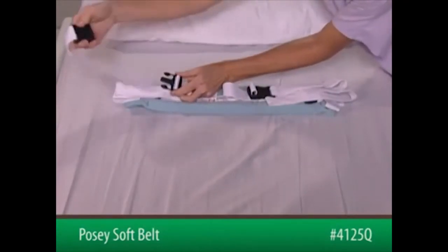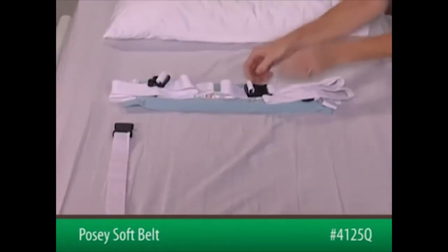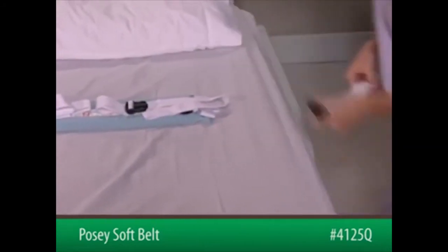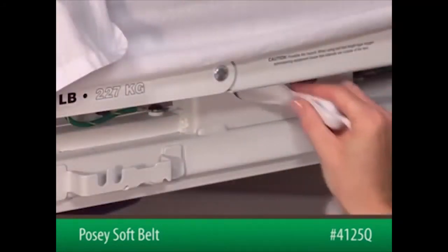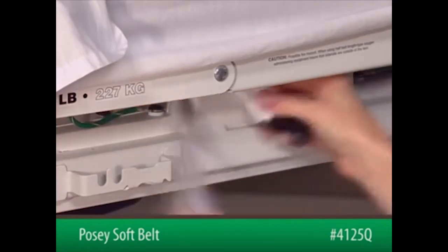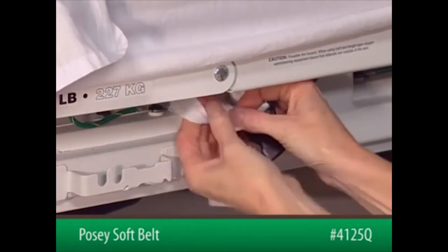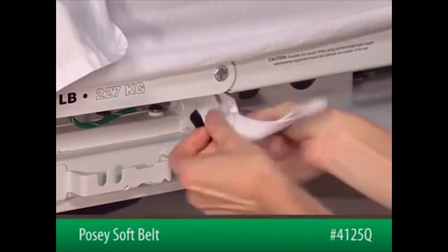To begin, squeeze the quick-release buckles to remove the short ends of each connecting strap. Wrap each end around a movable part of the bed frame at waist level, out of the patient's reach. Secure it by feeding the female end of the buckle through the loop in the strap.